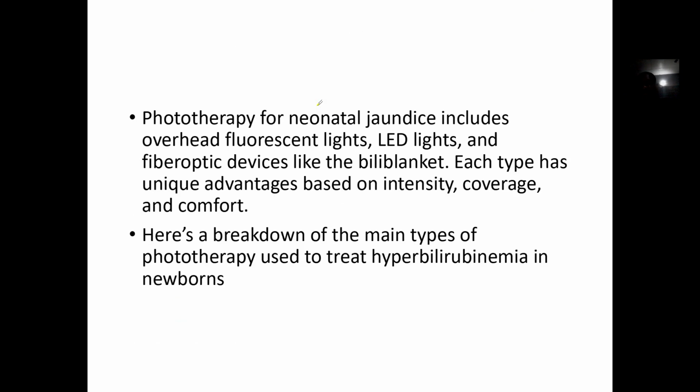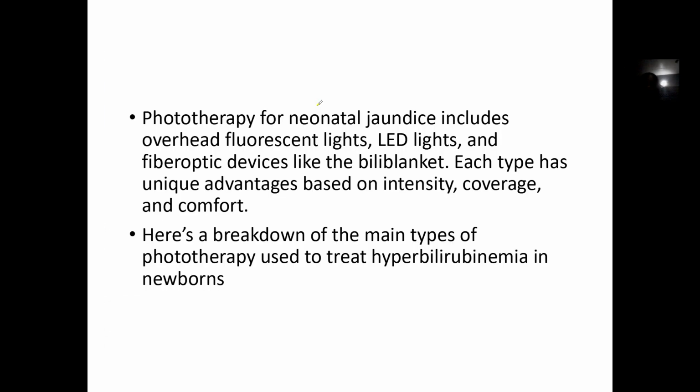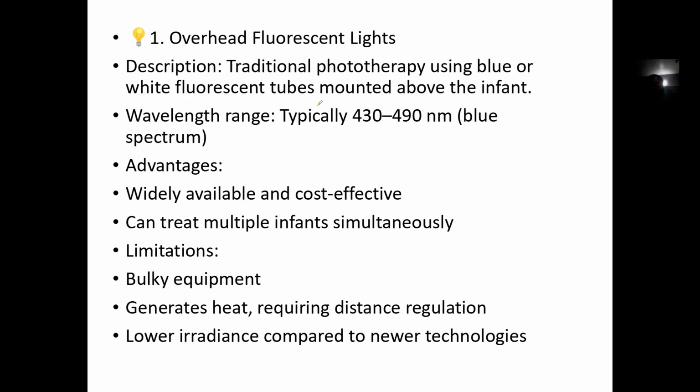So the overhead light, this is what we have, from the top. The overhead light is a traditional phototherapy. This is the most common one you see in almost every facility. It uses blue or white fluorescent tubes mounted above the infant, with wavelengths of about 430 to 490 nanometers.